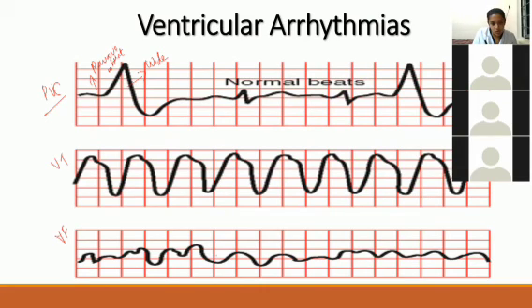Even the QRS is also not there, and no T wave, nothing is there. Complete disorganization, and this is the most lethal arrhythmia. If you get a question like the most lethal or most life-threatening arrhythmia, it is not ventricular arrhythmias in general, ventricular fibrillation is the most lethal one.